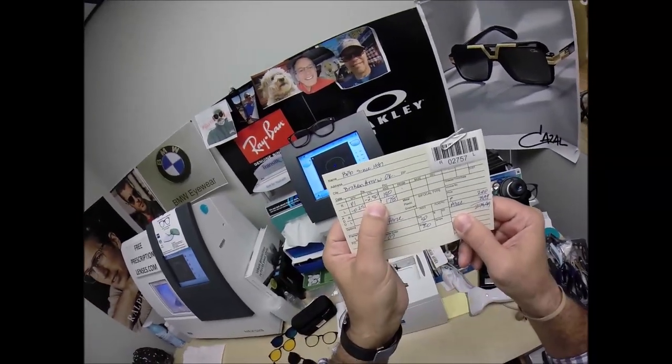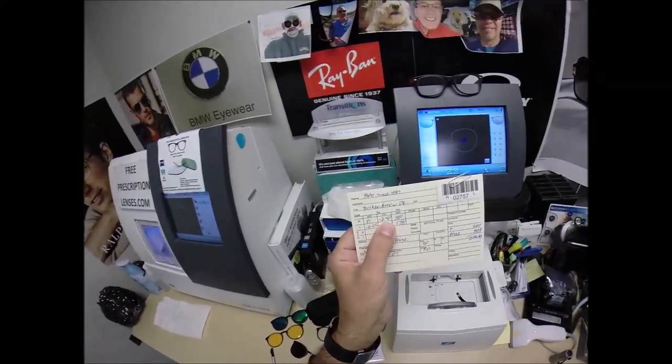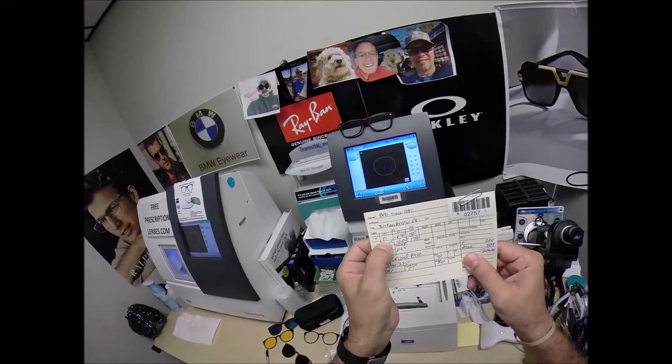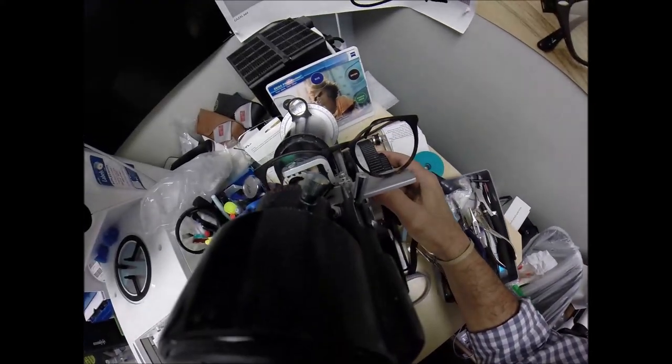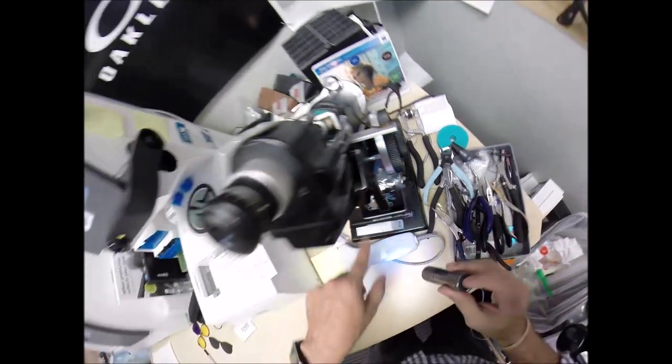So, you need no farsighted or nearsighted correction. Your prescription for the right eye is all astigmatic. So, as I mentioned earlier, uncorrected astigmatism makes sixes and eights look like the letters P and F. So, you need no magnification nor minification, but you do need 10 steps, two and a half diopters of astigmatic correction. And when we check that power, we have minus 250 exactly halfway between two and three.